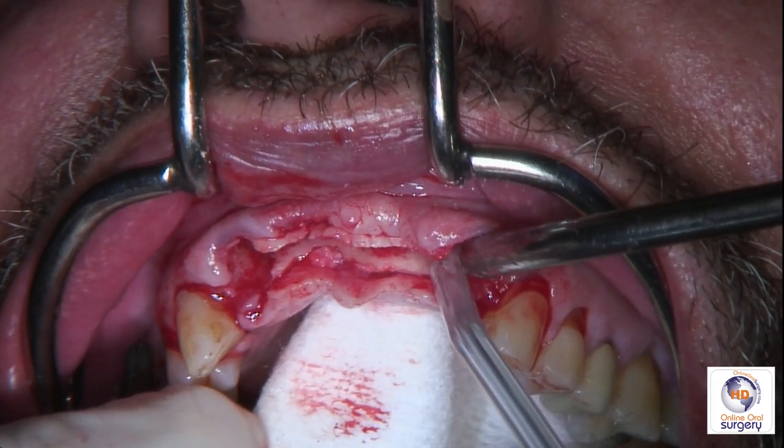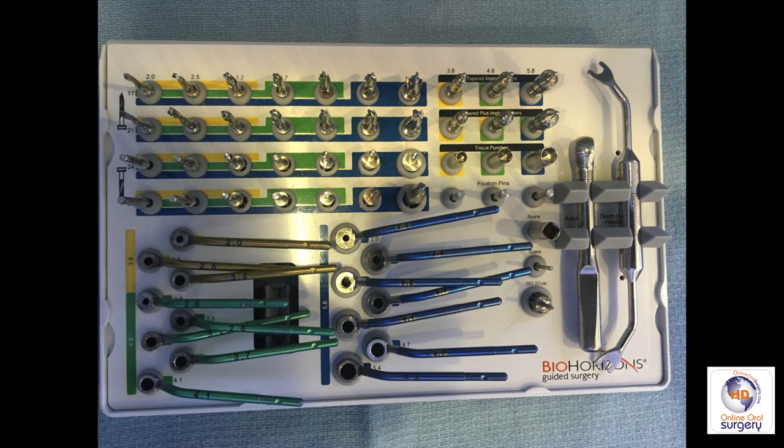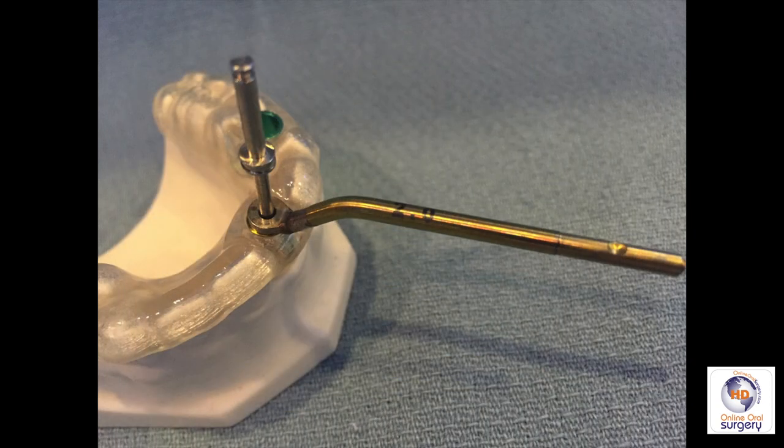Then we're going to thoroughly irrigate, and then we're ready to prepare the osteotomy sites with the BioHorizons Guided Surgical Kit. In contrast to a standard implant surgical kit, which only has drills, with a guided kit, we have drills as well as drill guides. And the drill guides act as a sleeve within a sleeve that's placed into a master guide sleeve, which controls the position, the angulation, and the depth of every osteotomy drill, as well as the implant when it's placed through the surgical guide.